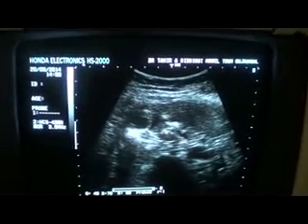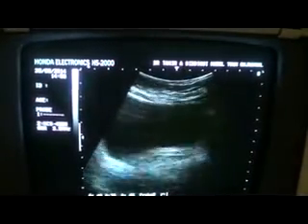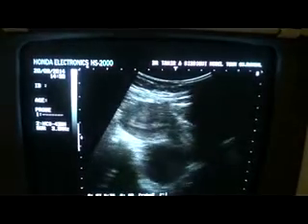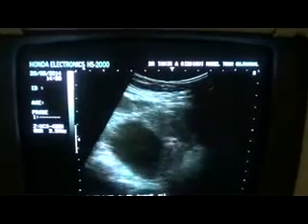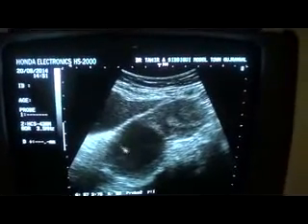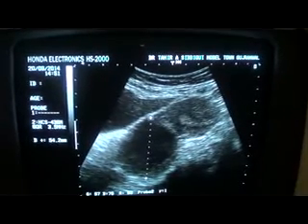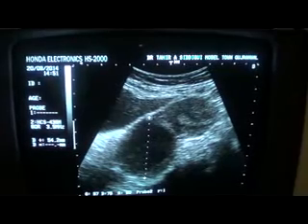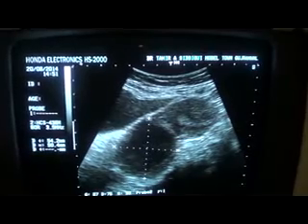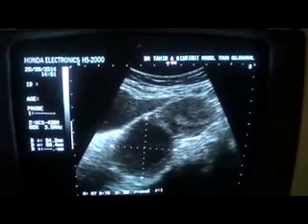Now, in the pelvic region, this is the urinary bladder, this is the uterus of this young female, and you can see that there is a clear cystic area that does not change its shape with the movement of the probe. This cystic area is in fact a right ovarian cyst that is clear of any echoes, septa, no calcification, no solid element, thin wall with posterior wall enhancement. Here you can see the uterus in transverse section, this is the endometrial canal, normal, central.